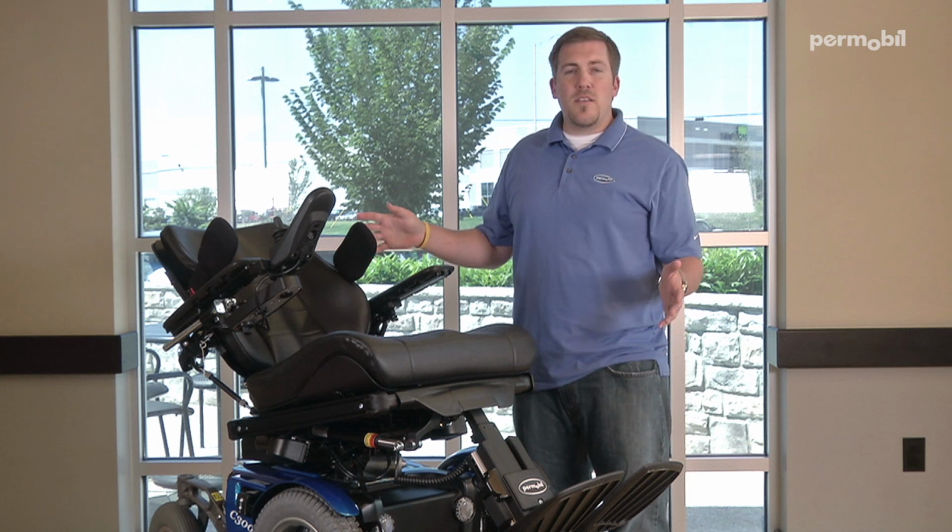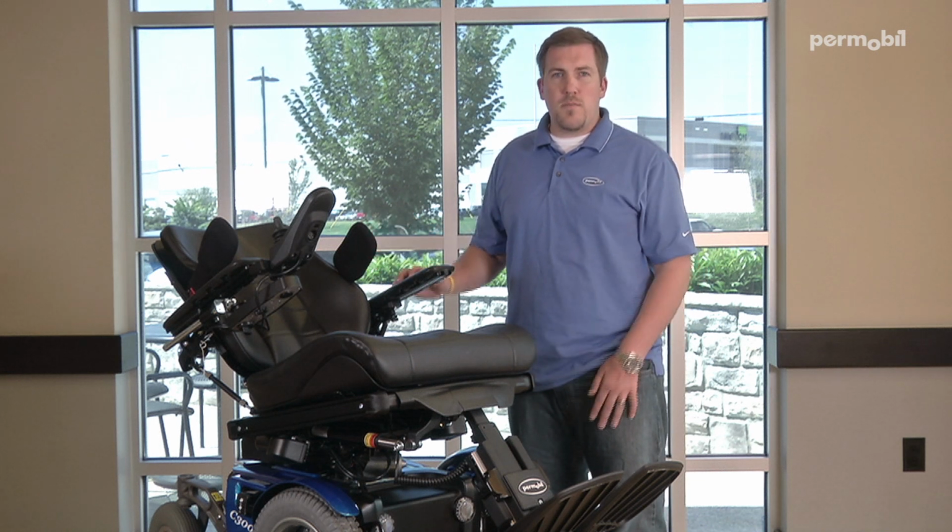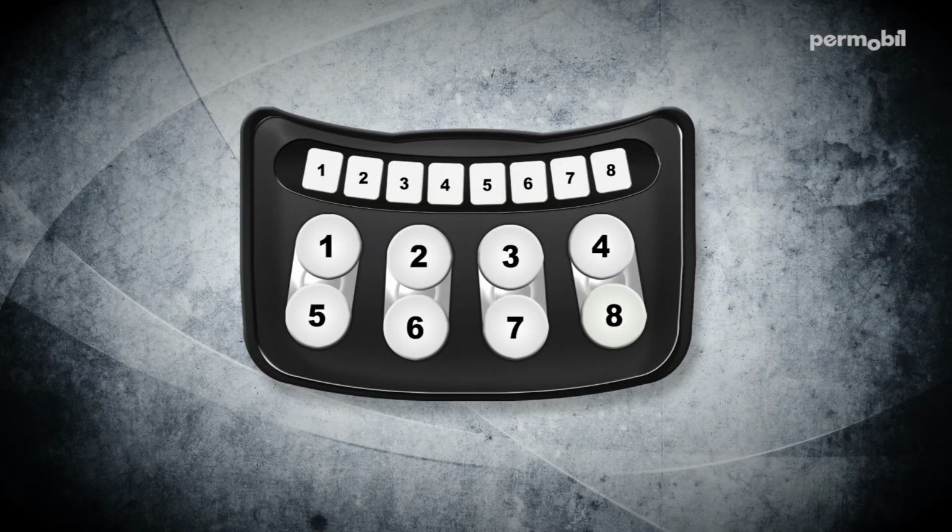Now that I have my chair in its desired position, I'm ready to store this position into the memory mode of the wheelchair. The first step in the process is to press and hold button number 8 on the switchbox. To indicate memory mode, look for the LED number 8 behind the floppy disk to start flashing green. Once you see this, you now know that you've entered into the memory mode of the chair. With my chair already in its position, I'm now going to select the position in which I want to store that memory mode. Remember, buttons 1, 2, and 3 are for recalling memory, whereas buttons 5, 6, and 7 are for storing the memory. Those buttons coincide with each other in their respective columns.